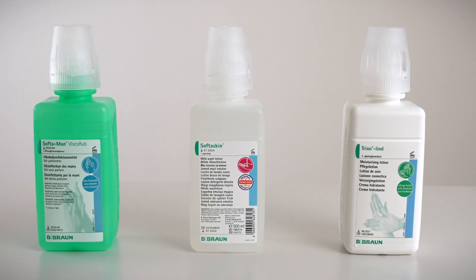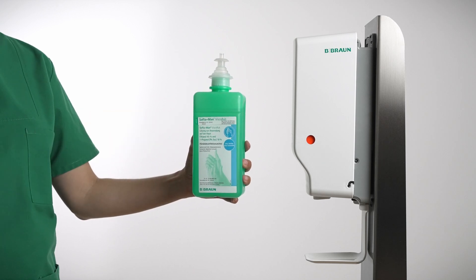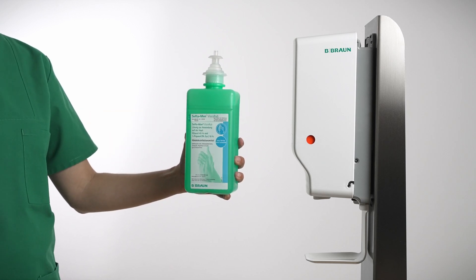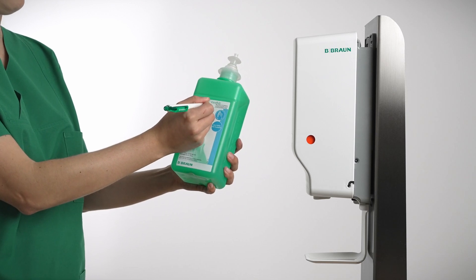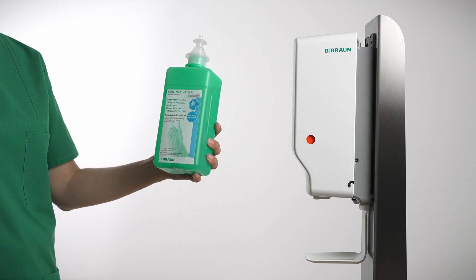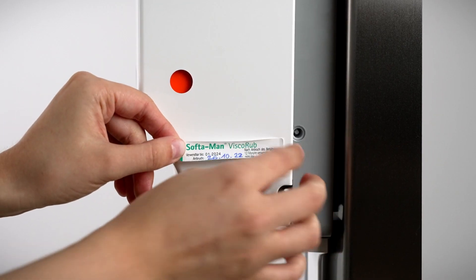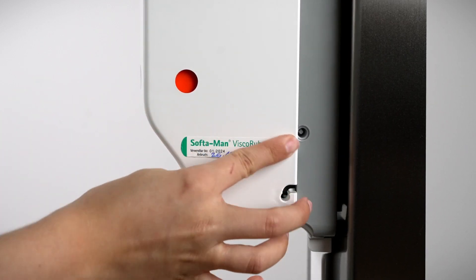The Automatic Dispenser was designed to provide a clear indication of what product is being dispensed, how much product is left in the collapsible bottle, and when the bottle was opened. Our bottles have an additional sticker attached on the label where you can record when the bottle was opened.